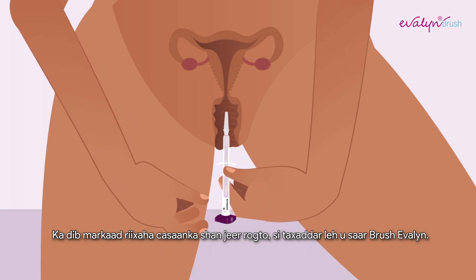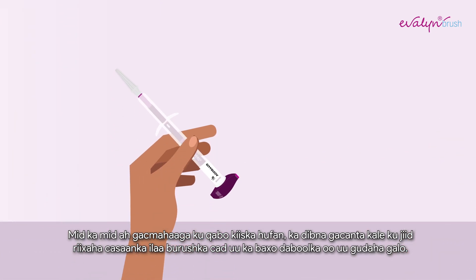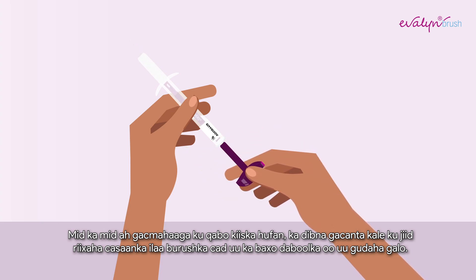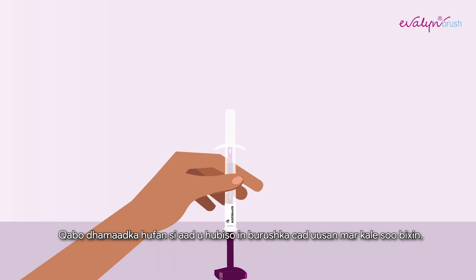After turning the plunger five times, carefully remove the Evelyn Brush. Hold the transparent casing with one hand and with your other hand, pull on the pink plunger until the white brush disappears into the casing. When doing so, do not touch the top part of the Evelyn Brush above the wings. Hold the transparent end to ensure the white brush does not extend again.